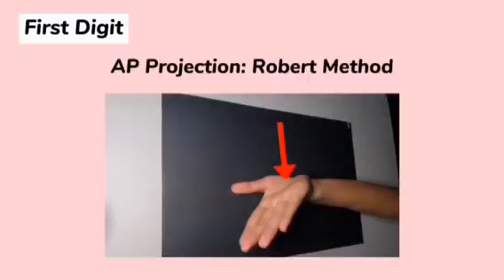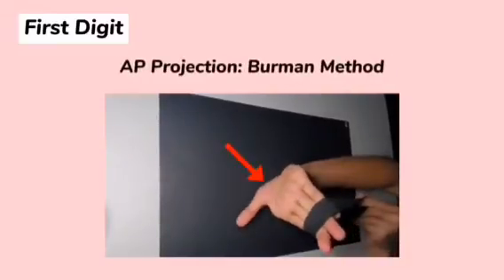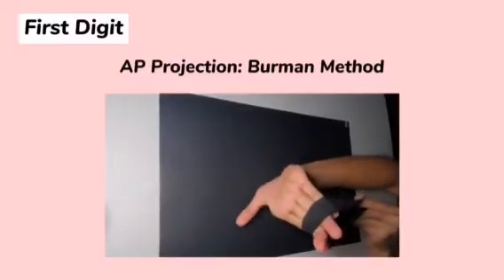Long and Rafford state that the patient may hold the fingers back with the other hand. Place the IR under the wrist and center the first CMC joint to the center of the IR. Hyperextend the hand and have the patient hold the position with the opposite hand or with a bandage loop around the digit.